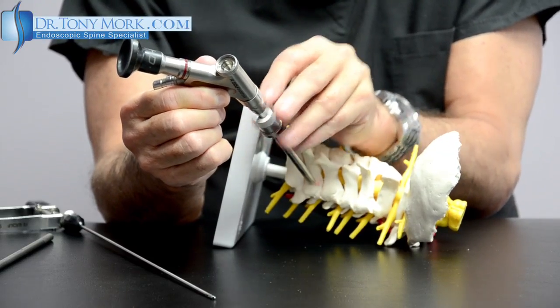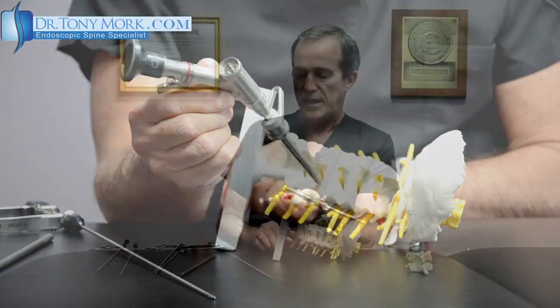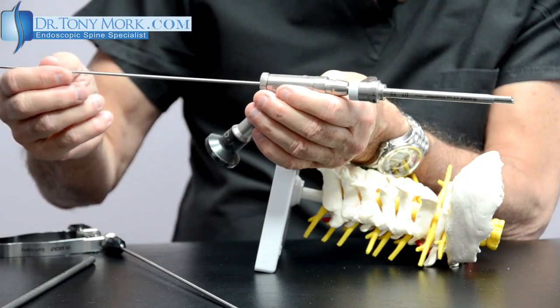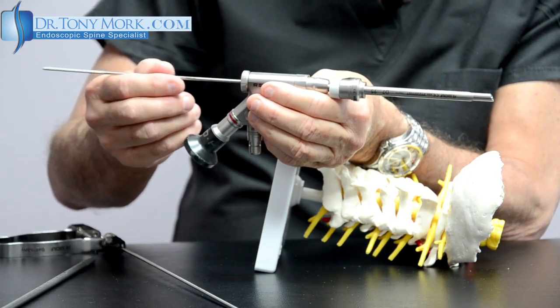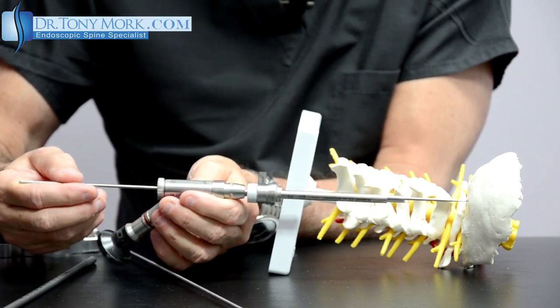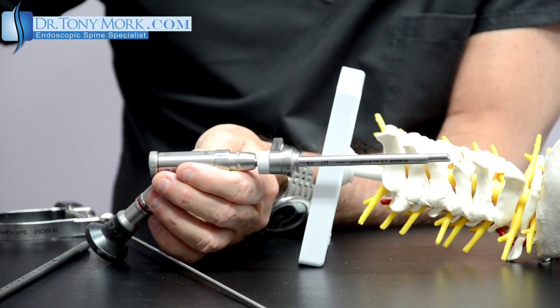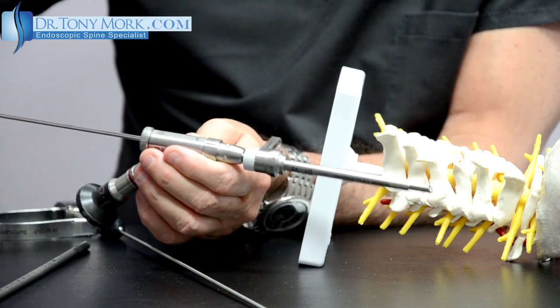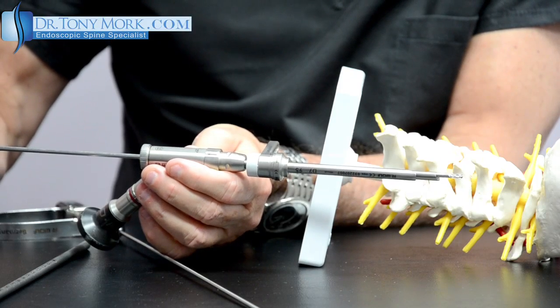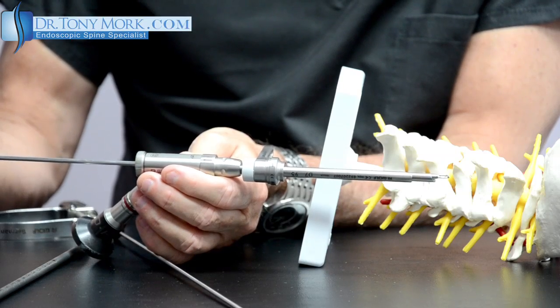Now watch this — I'm going to show you a few things that we can pass through here down to the surgical area. All these instruments pass through the inside of the endoscope. This is a very small soft tissue dissecting unit that can lift off soft tissues or separate different tissues from one another. Once down to the bone, this very sharp little burr — which also passes right through the endoscope — can actually remove bone under direct vision.